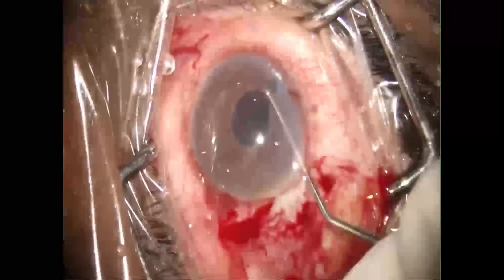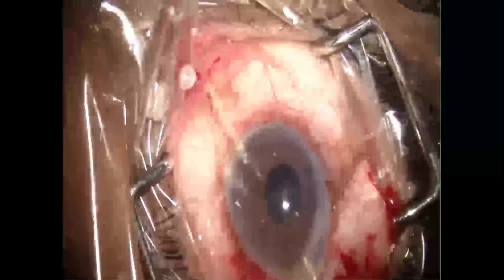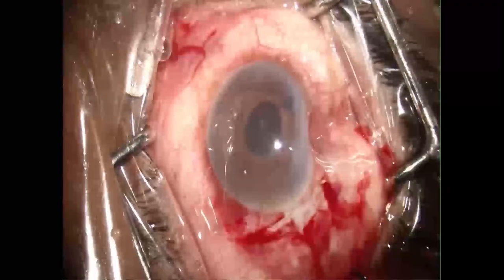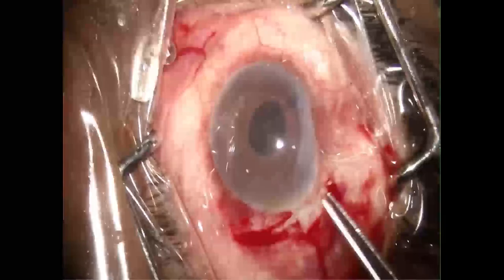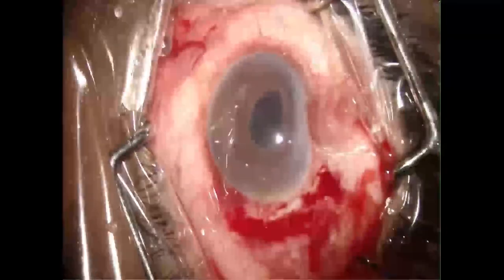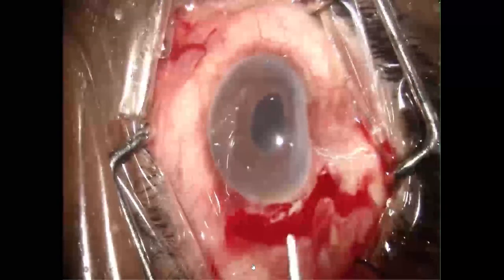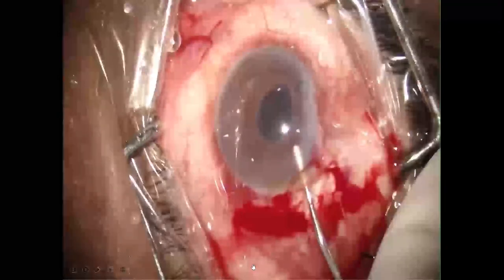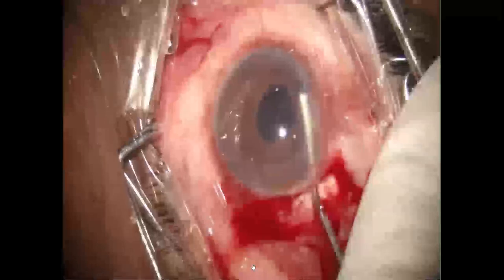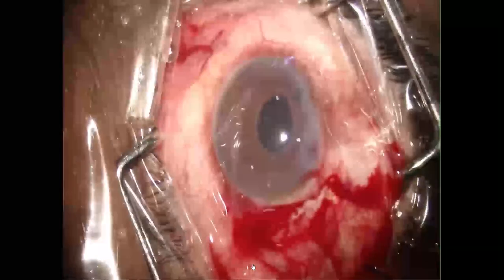And the IOL was just dialed out. Interestingly, no adhesions were found between the haptic and the angle structures. There was no evidence of any trabeculitis or anything of that sort. And the IOL could be explanted very easily. So intraoperatively on table, what we observed was there was a vitreous blob which was blocking the pupil and the PI. And that was in fact causing the rise in IOP.